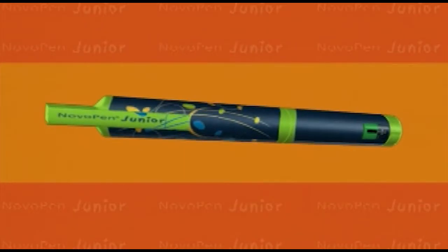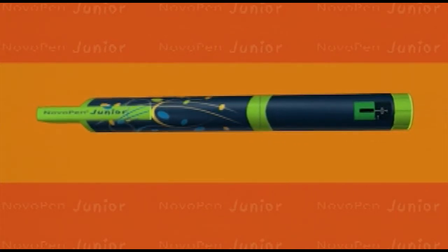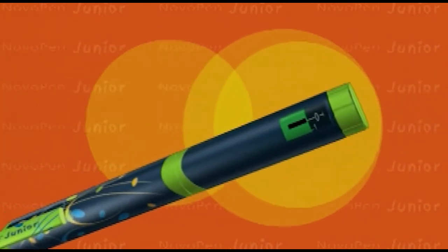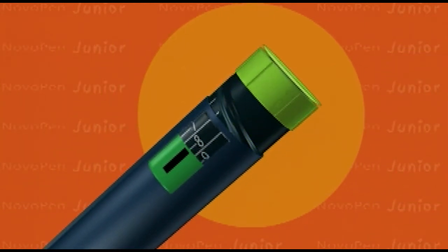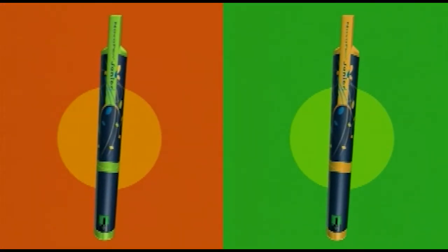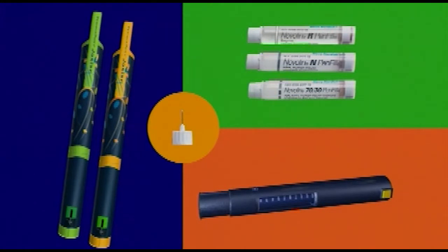NovoPen Jr. is the first complete diabetes management system designed with children and young adults in mind. NovoPen Jr. offers all patients with diabetes the ability to fine-tune insulin doses with half-unit increments, 1 to 35 units. The pen is also available in two fun, energetic colors to allow for insulin differentiation and flexibility. This video is designed to help better acquaint you with the parts of your NovoPen Jr. diabetes management system, as well as to explain how to best use it.